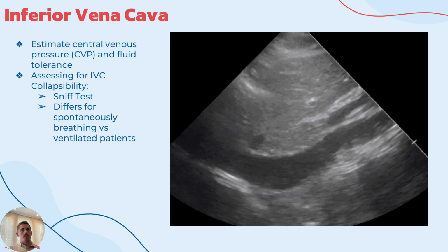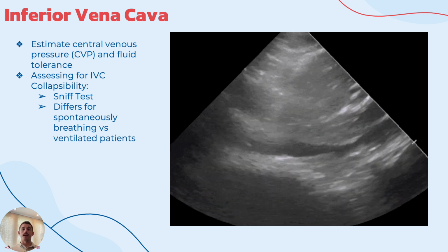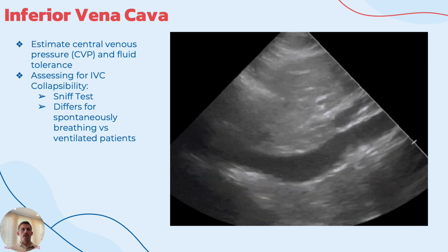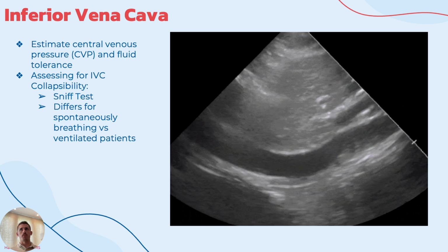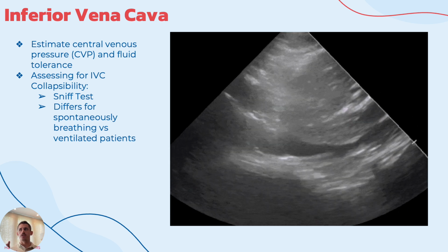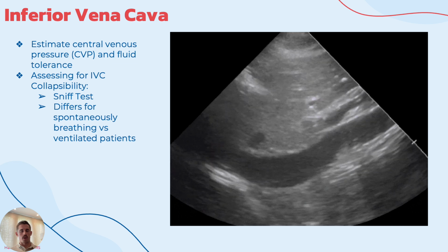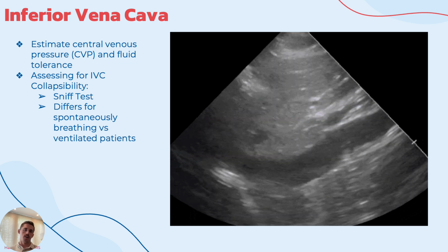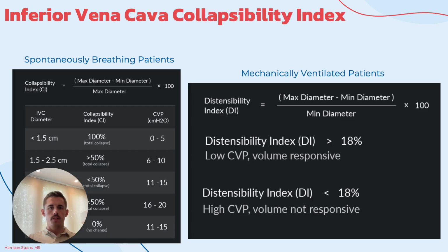And I see a lot of people starting to learn about IVC and looking at the aorta. With such big vessels, you can't necessarily rely on the compressibility. You also don't know if your image is getting both of these or if you just lost the IVC and you're replacing that in your head with the aorta. So I kind of rely on dumping into the right atrium for the inferior vena cava identification.